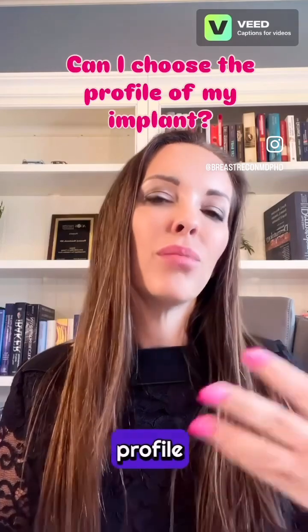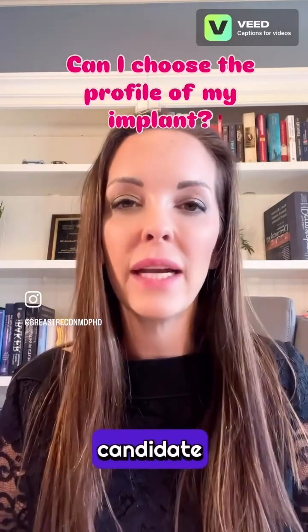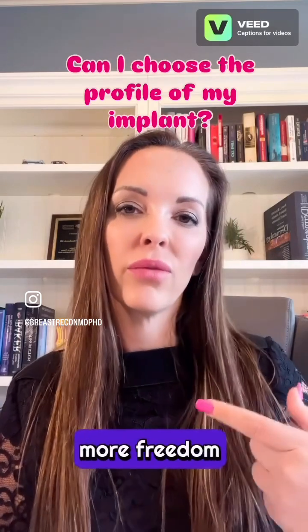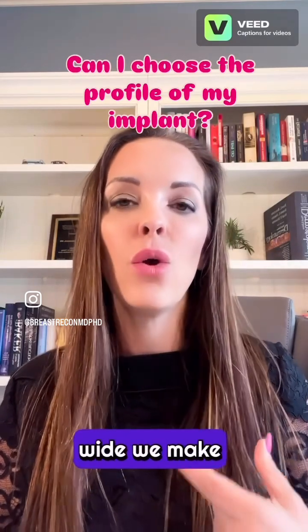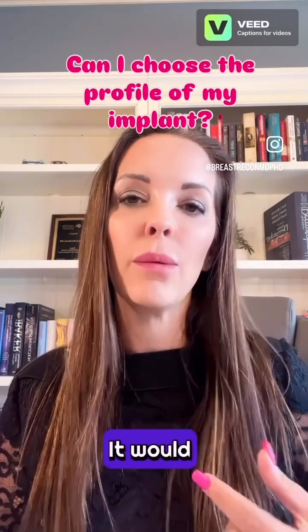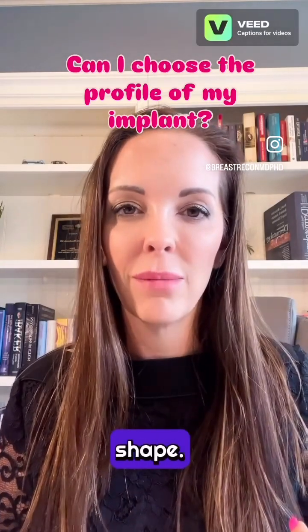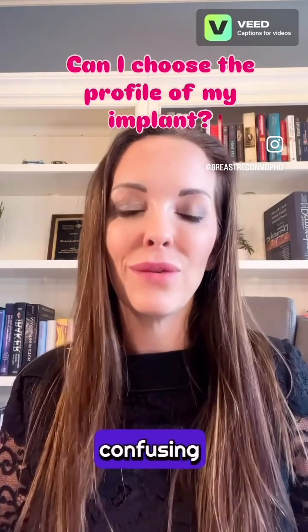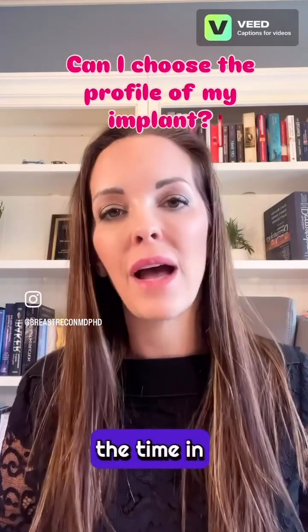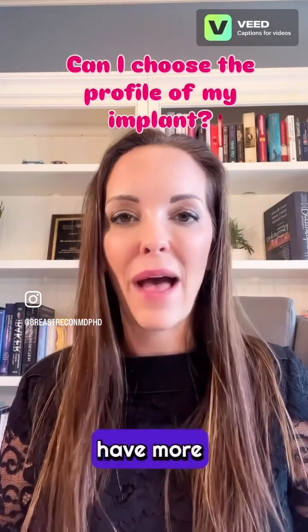Now, this profile discussion becomes more relevant when you're a breast augmentation candidate, because once again, we have a little bit more freedom about how wide we make your implant. But in reconstruction, we don't. It would look weird. It would look like you had a little softball on your breast as opposed to a natural breast shape. This is a really confusing concept, and I talk about it all the time in clinic. Let me know if the example made sense for you or if you still have more questions.